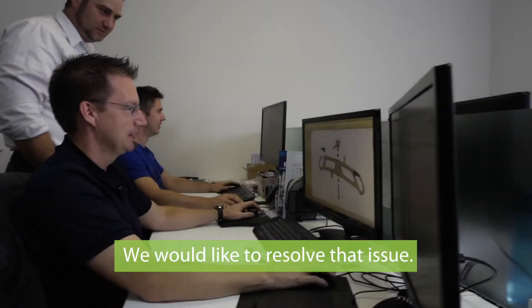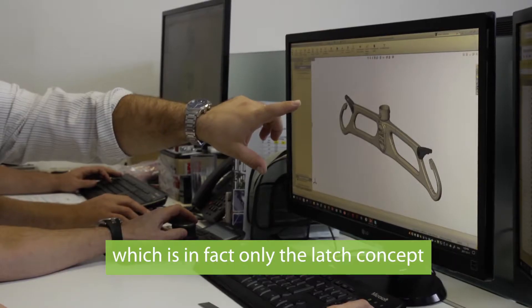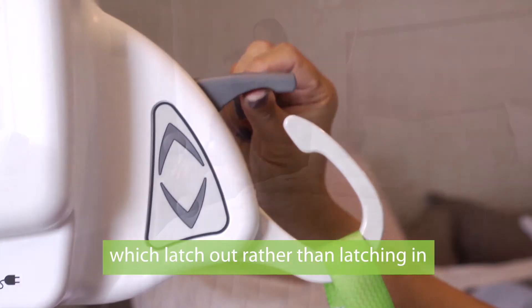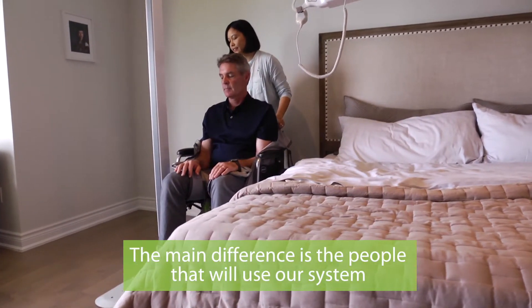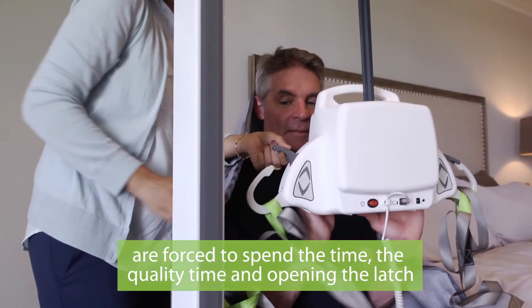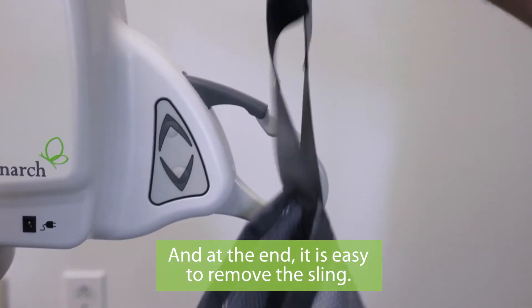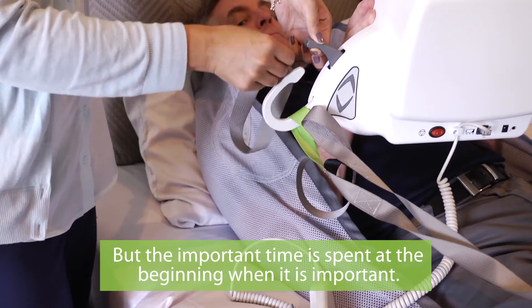We would like to resolve that issue. We developed the short clip system, which is in fact only the latch concept — it latches out rather than latching in. The main difference is that people using our system are forced to spend quality time opening the latch to attach the sling. At the end it's easy to remove, but the important time is spent at the beginning, when it matters.